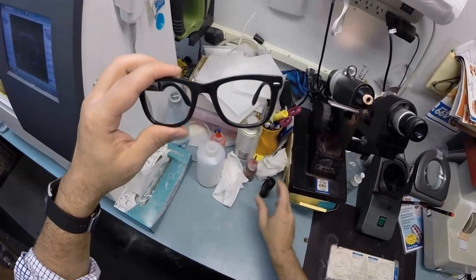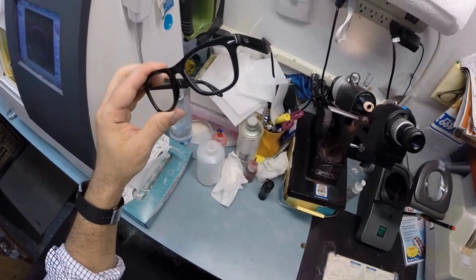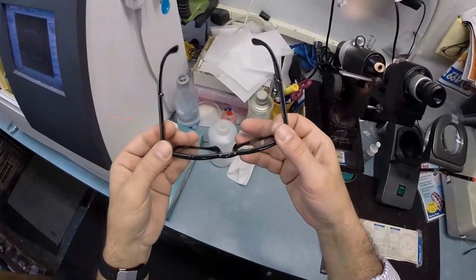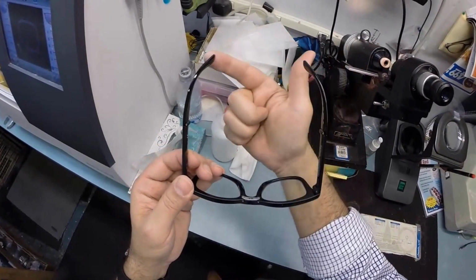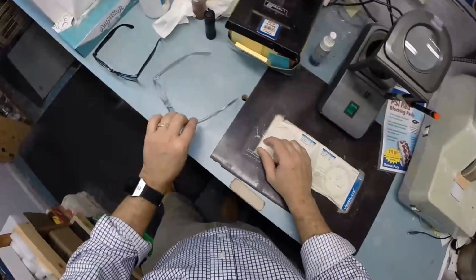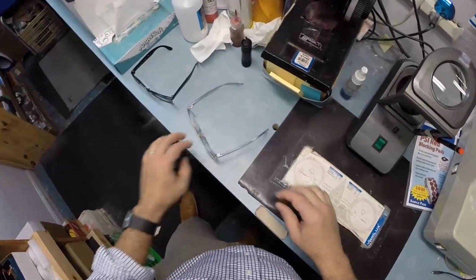But because of that statistic, 99% of all optical shops will do free adjustments if you ask them. So just stop by your local shop, and it only takes about 30 seconds to a minute to adjust a pair of glasses properly. But I'm going to get these in standard alignment first, also known as the 3-point stance. The 3 points are 1, 2, and the bottom of the frame being 3. I set them on the counter and press down. There is no wobble. When I say wobble, I take mine off and I press down. Mine wobble on the counter, but they sit level on me.